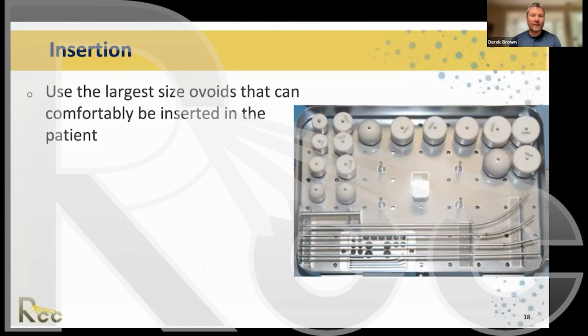So if they're feeling not very confident about being able to get the tandem in the right place, then they'll ask for the ultrasound. They'll do a transabdominal ultrasound while they're doing the insertion, and then they can be sure that the tandem is getting into the uterus. But yeah, image guided anything is good.